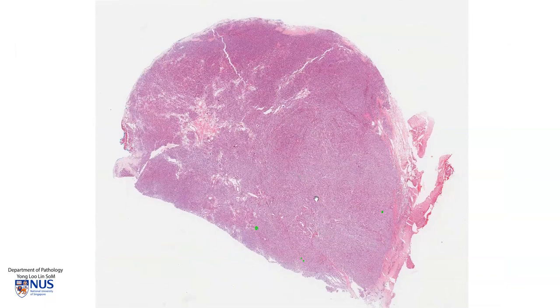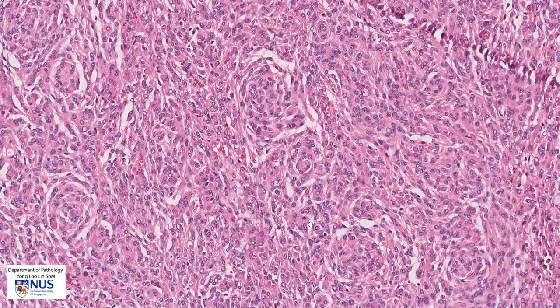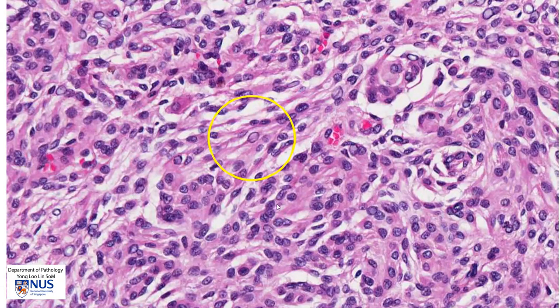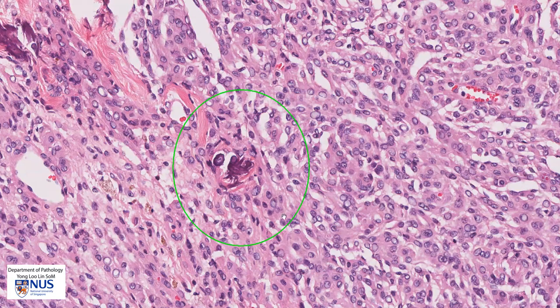In summary, this is a meningothelial meningioma with sheets of polygonal uniform cells with oval nuclei, with meningothelial whorls, with occasional intranuclear pseudoinclusions — and another nice example can be seen here — and also occasional psammoma body calcifications.